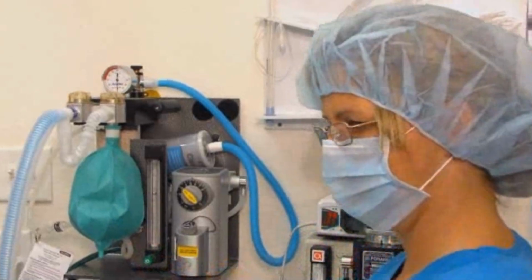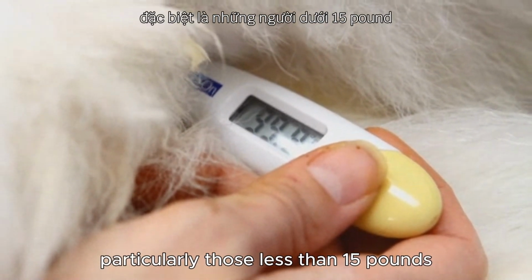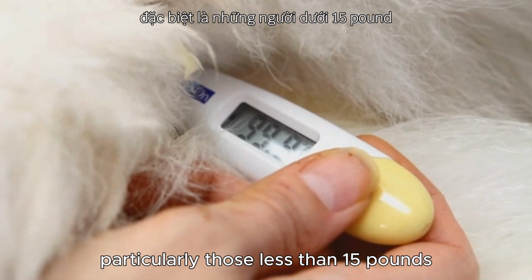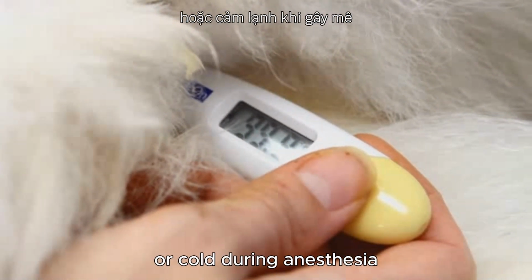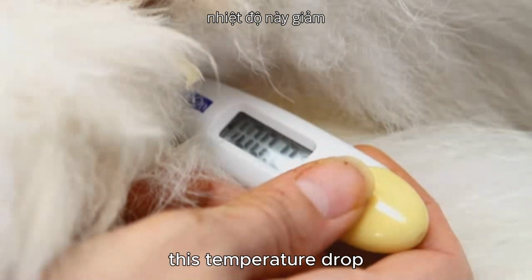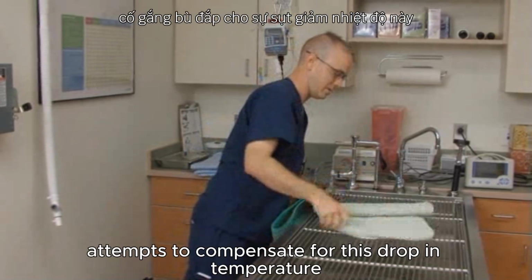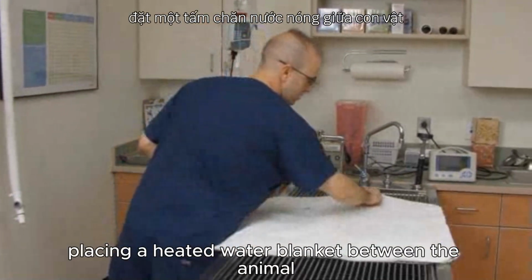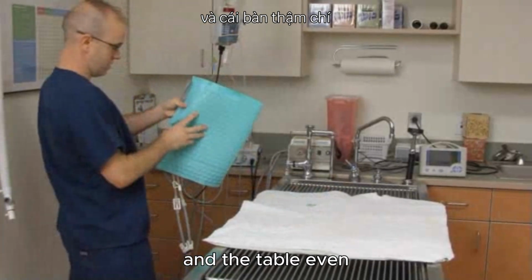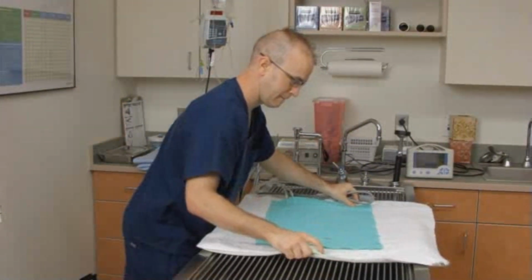Monitoring body temperature is important because many patients, particularly those less than 15 pounds, are very susceptible to becoming hypothermic, or cold, during anesthesia. This temperature drop can be monitored with a rectal thermometer. Attempts to compensate for this drop in temperature include placing a heated water blanket between the animal and the table. Even a common bath towel will help to prevent heat loss to the metal table.